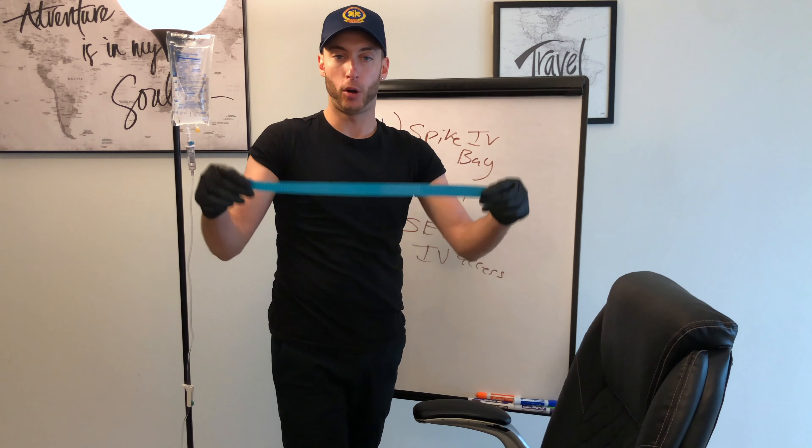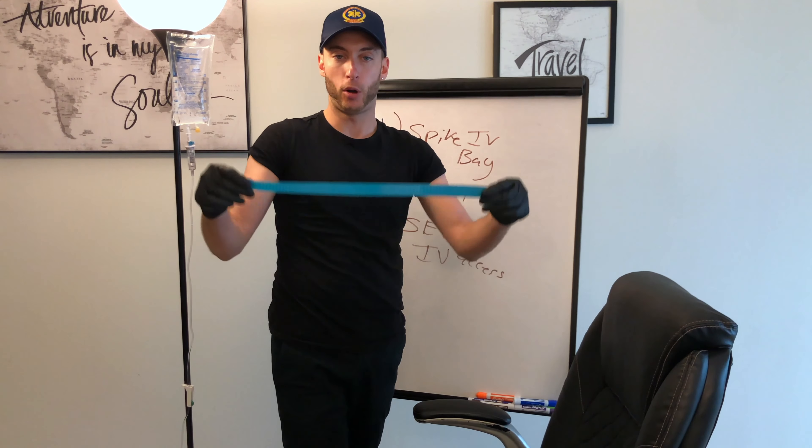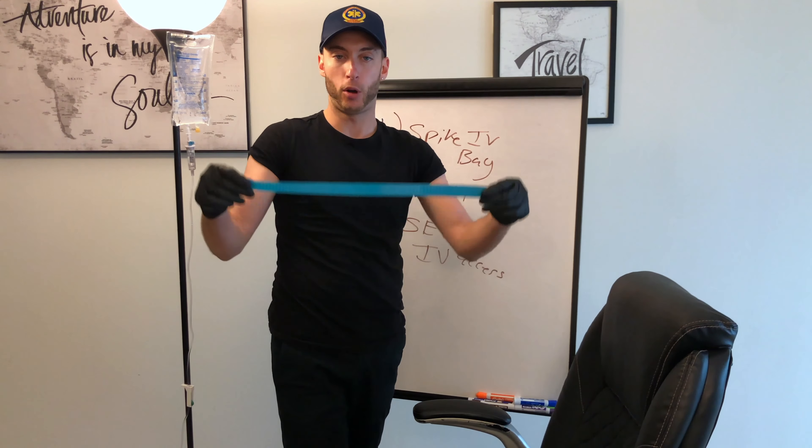Here it sweeps underneath. Here we go again. I'm going to bring this up so maybe you can see a little better. Underneath — here we go. Pull tight, pull tight. Left finger right underneath both. Throw it over. Tuck that baby in. I'm going to do it fast now. So we're going to do a quick IV. Just going to put a quick tourniquet on your arm, okay? You're going to feel a little poking. That's it.